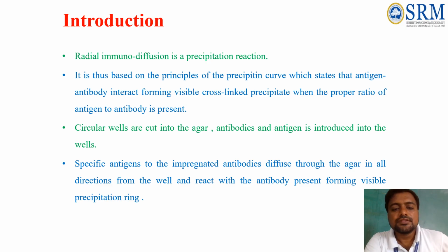So, single radial immunodiffusion is a type of experiment where we try to understand the presence of antigen and also its quantification.